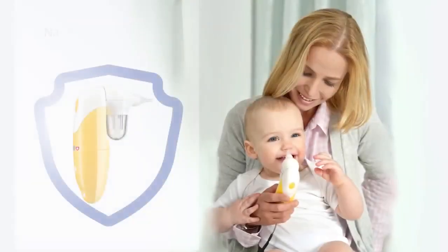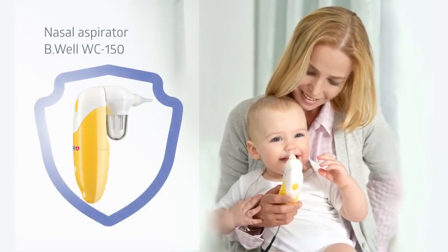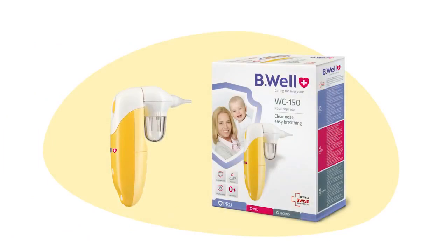BeWell, caring for everyone. Nasal Aspirator BeWell 150. Clean nose and clear breathing.